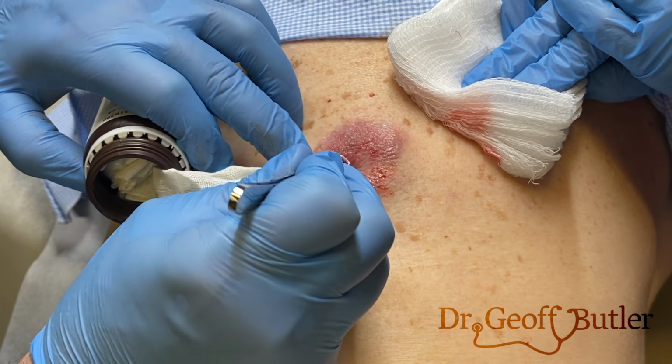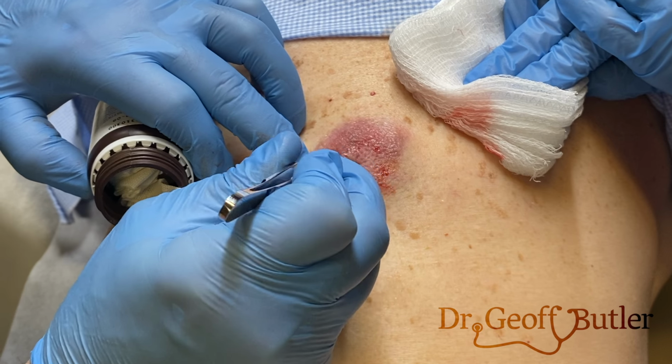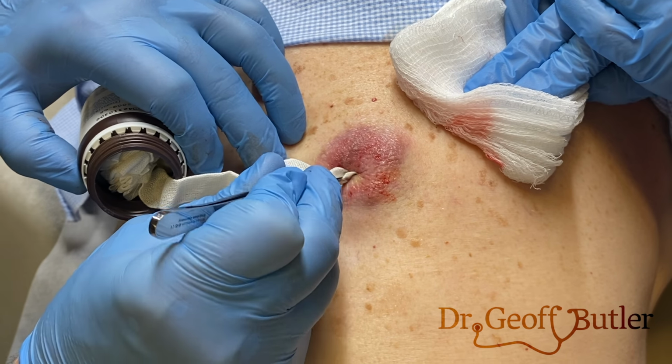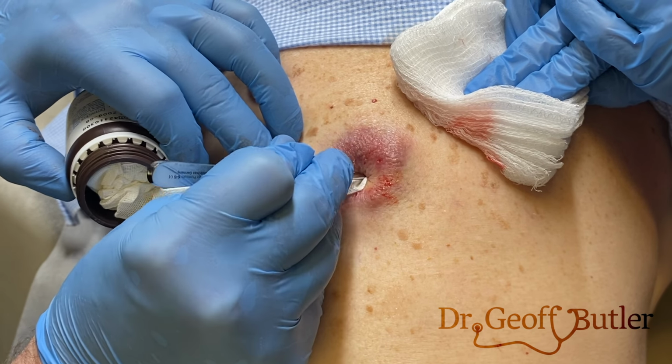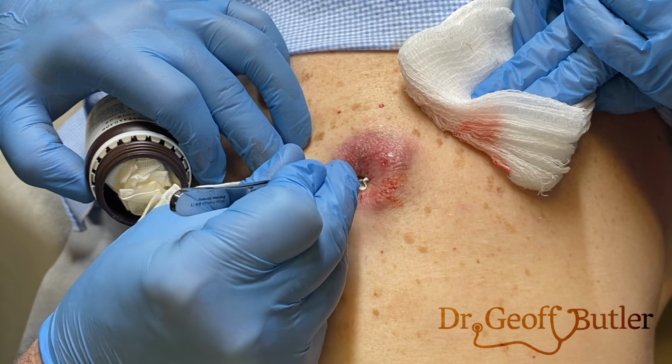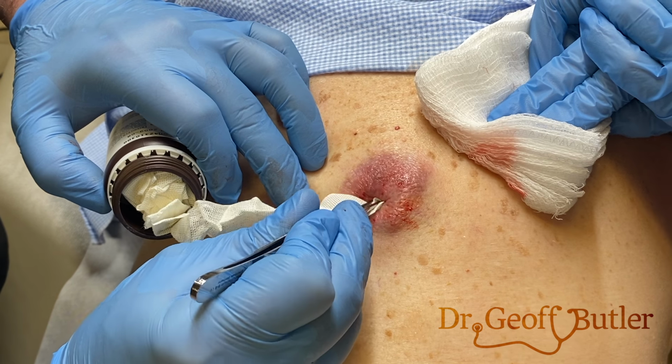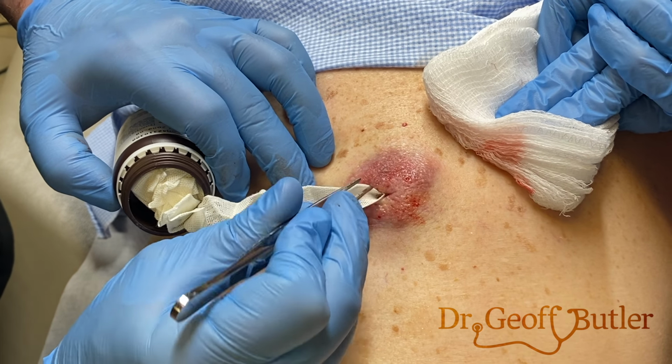This may not pack as well. You okay? Mm-hmm. So packing is something that we used to do a lot more of. We used to do this for weeks and weeks. Now we typically just do this overnight. So there's anesthetic in right now, so it's not terrible putting this in. That's not too uncomfortable for you?